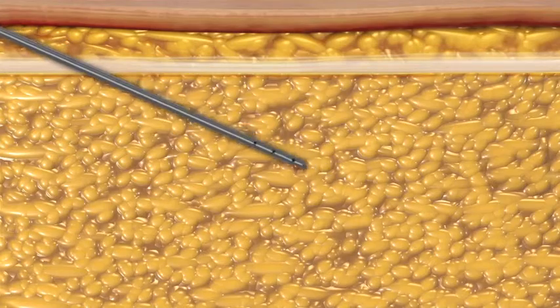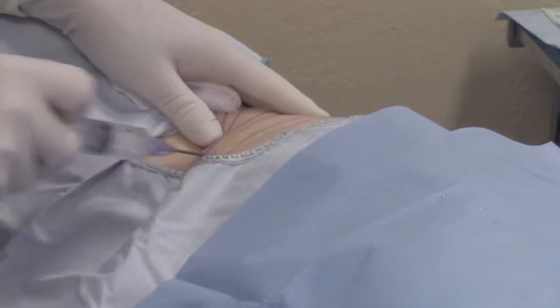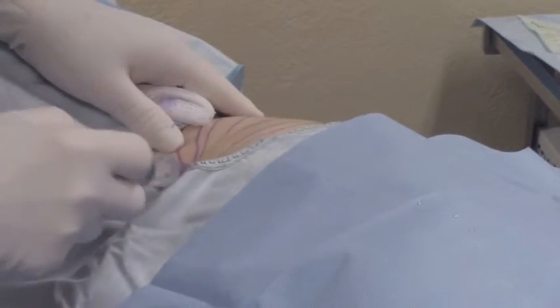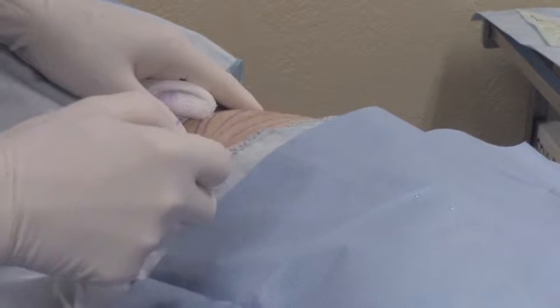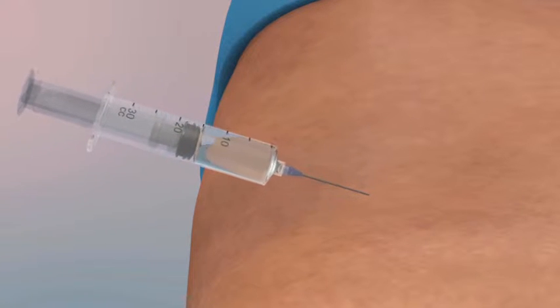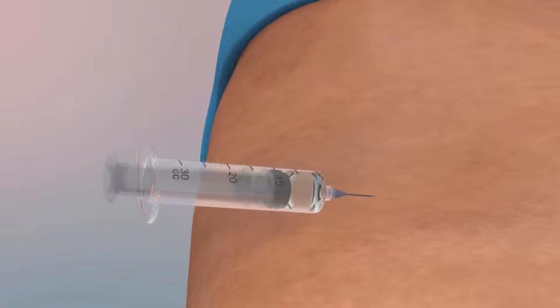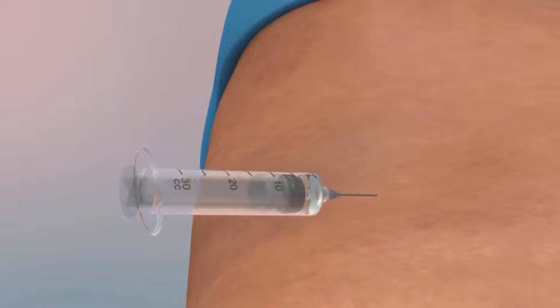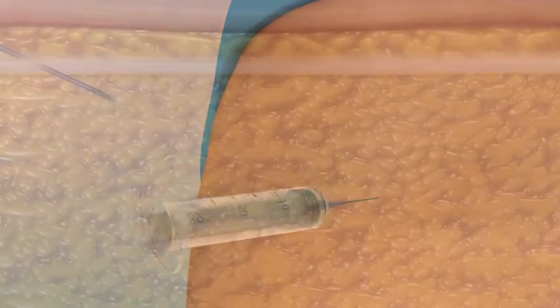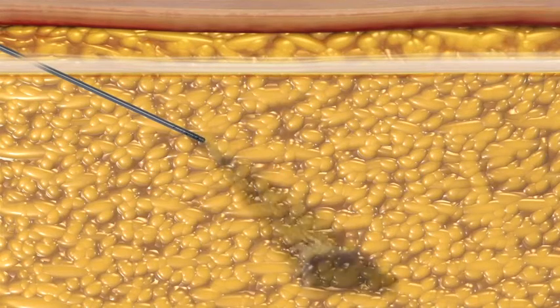The cannula should perforate and remain below Scarpa's fascia in the abdomen. Pass the infiltrator cannula in a horizontal manner within the fat deposit, creating a spokes-on-the-wheel pattern. Slowly inject tumescent fluid during both entry and withdrawal strokes. It is important to evenly distribute the tumescent fluid during injection and avoid pooling of fluid within the donor site. As a general guideline for small volume liposuction, at least one milliliter of tumescent fluid should be injected for every one milliliter of lipoaspirate to be collected.